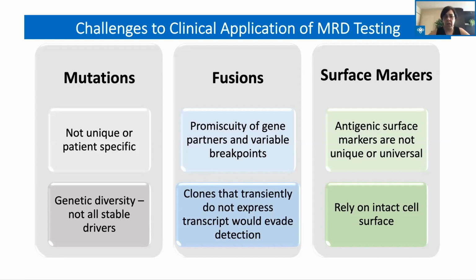Another thing is that sometimes the clones are not necessarily expressed at every point. So if transiently the disease is not expressing the transcript, sometimes these diseases can evade detection.